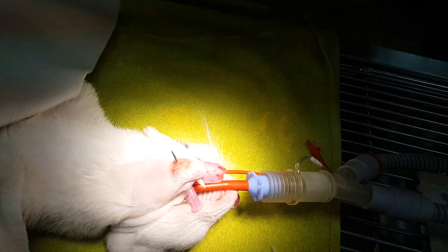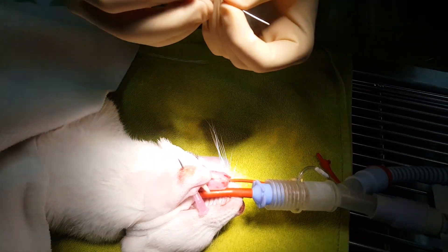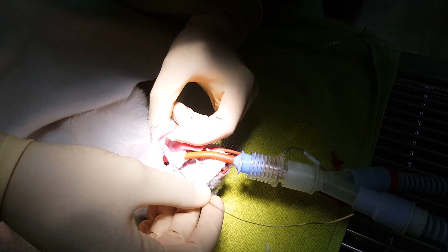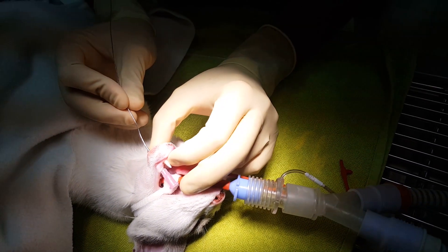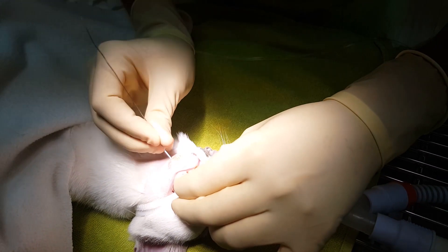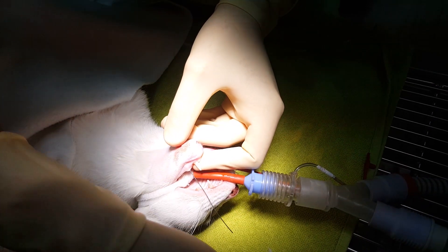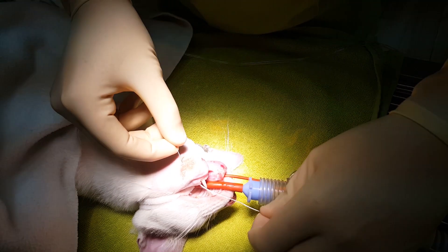This needle is going to work as a guide to insert the metal wire, which will keep the jaw attached together. The wire goes through the needle, and then what we're going to do is take the needle out while holding the wire in place.